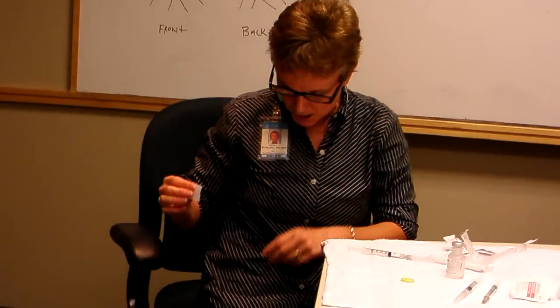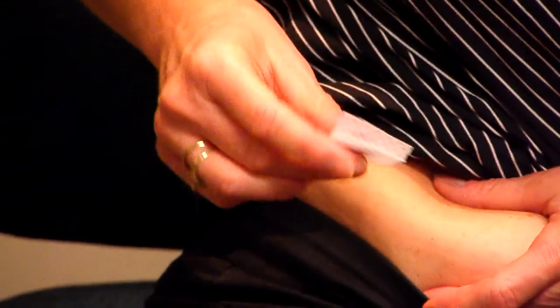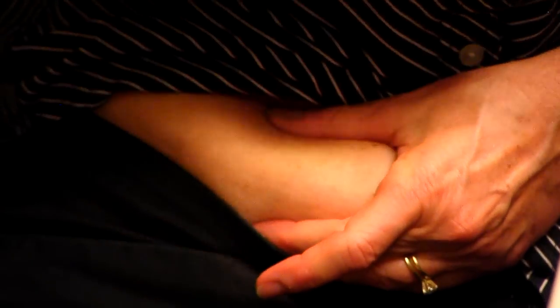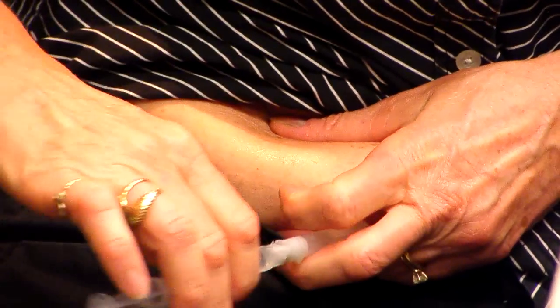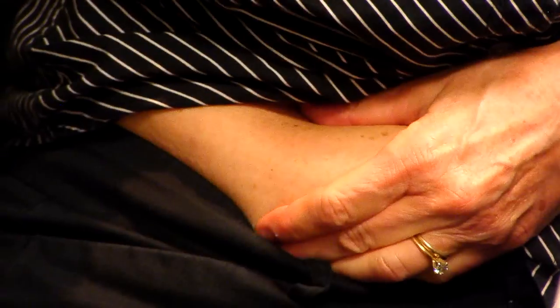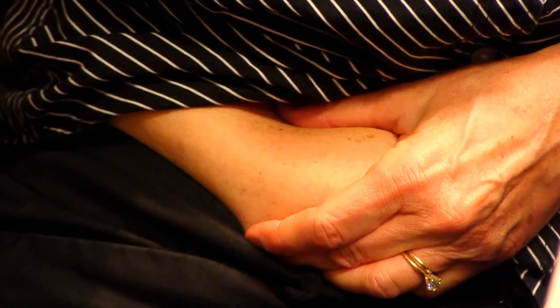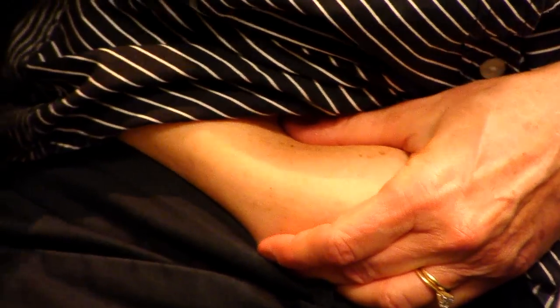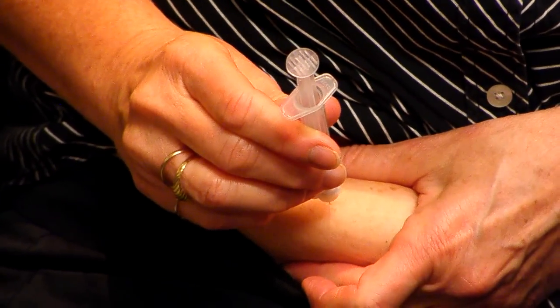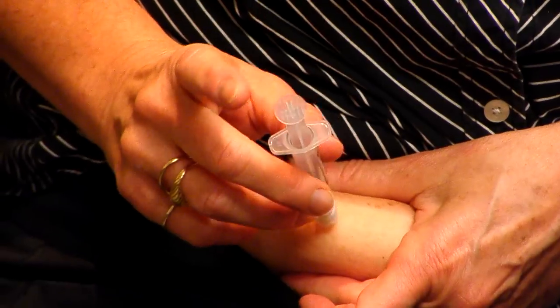So, you're ready to inject. Here I'm going to use the fat of my belly. I'm just going to wipe off using the same alcohol swab that I used for the bottle. You take the needle and syringe unit, you hold it like a dart or a pen. Take the needle tip, push it right up against your skin, and push.